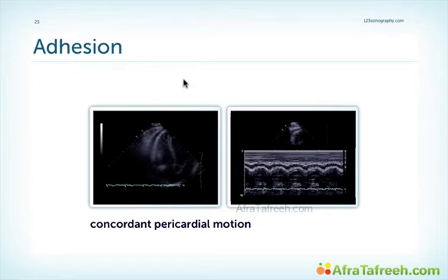Here's another example, a 4-chamber view where we are focusing on the right ventricle. This patient has a more seroeffusive type of pericardial constriction. There's probably a form of organized pericardial effusion here. But nevertheless, we see a motion of the pericardium and the adjacent tissue parallel to the motion of the right ventricle. This can also be demonstrated with the help of M-mode. Note how the pericardium and the adjacent tissue parallels the motion of the right ventricle. This usually does not happen to the same extent if we only have pericardial effusion without constriction.